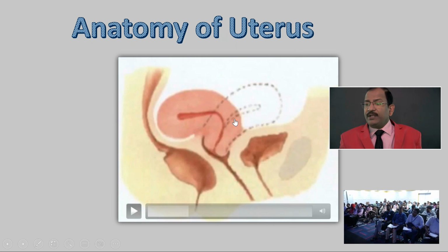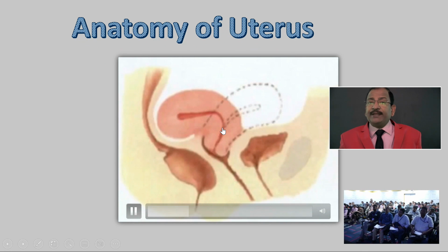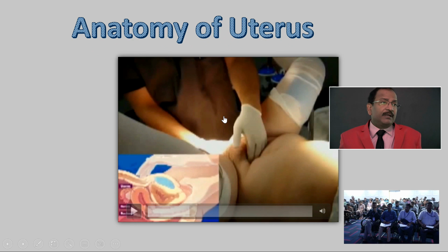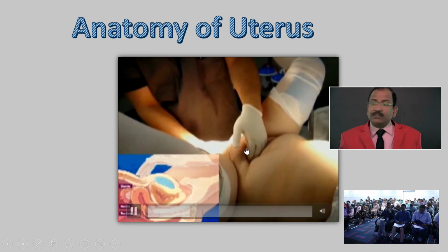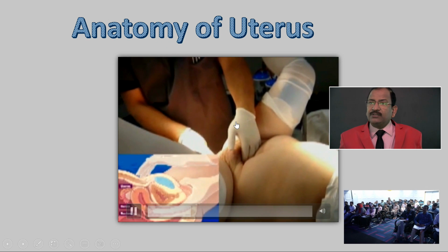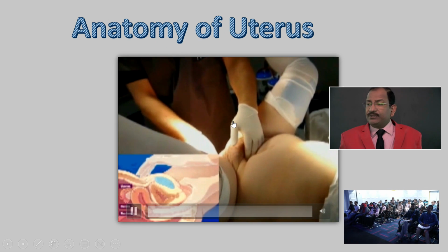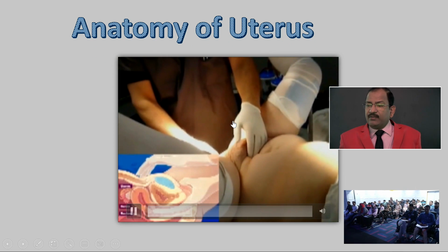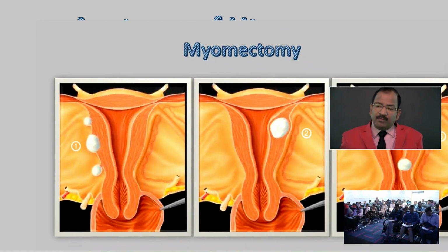because if you are going with the 30 degree, you should keep the light cable up, otherwise you will enter into the abdomen. So according to the bimanual examination, you should decide how to enter with your hysteroscope, and 0 degree will be preferred compared to laparoscopy.